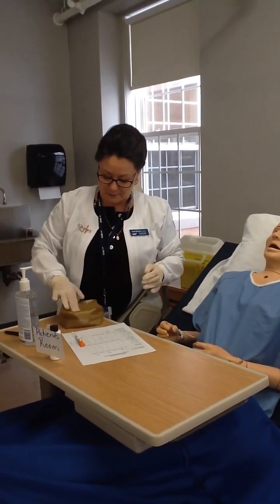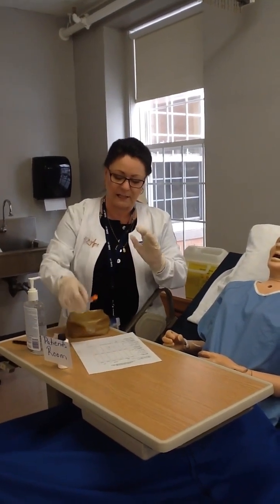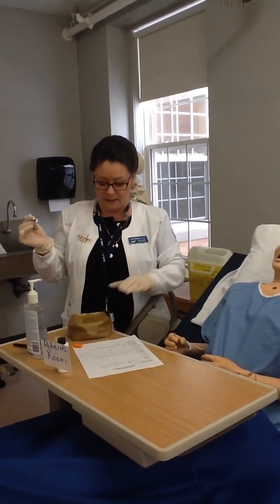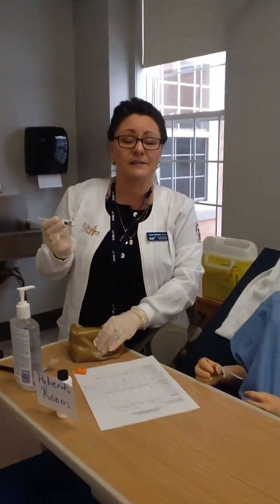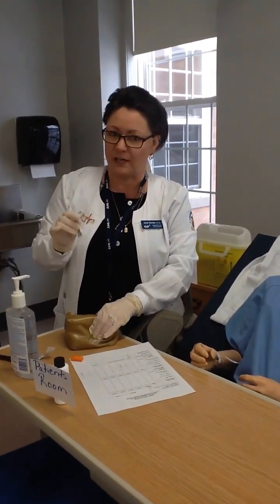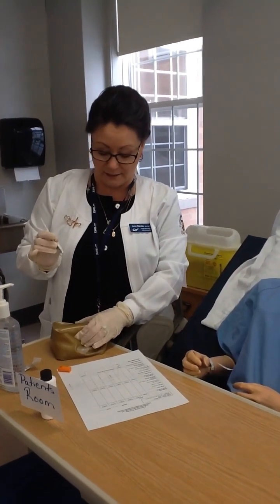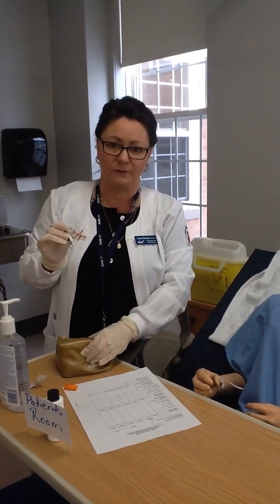So I'm going to swab a nice area. I'm going to put that between my fingers so that it's there and easily accessible for me. I'm going to pull that cap straight off and away. I'm going to pinch a good 5 centimeter fold of skin. That means I can inject at a 90-degree angle, so 5 centimeters, I can inject at 90. 2.5 centimeter fold, we're going to inject at a 45. I can inject at a 90 because I can easily grab a 5 centimeter fold of skin.